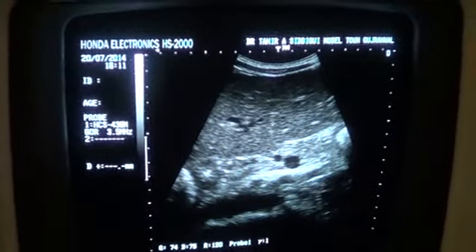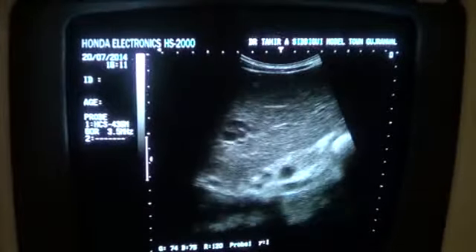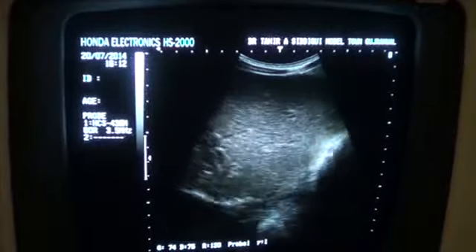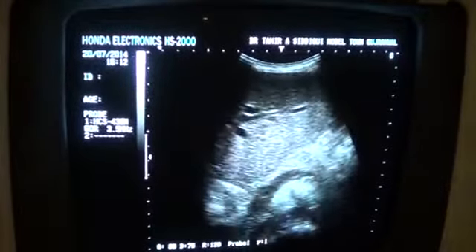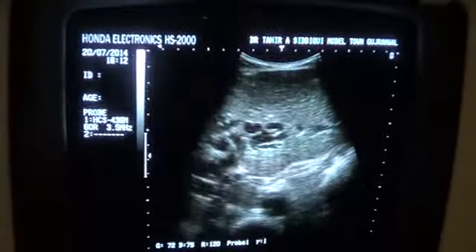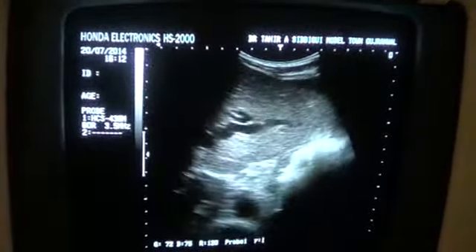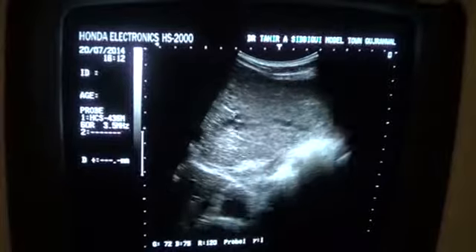The left lobe of the liver is enlarged, seen extending beyond the origin of the superior mesenteric artery from the aorta, and the intrahepatic bile ducts can be seen dilated in this location as well. Now these are all dilated intrahepatic bile ducts that are seen dilated at all levels, and moreover they reach the periphery of the liver. You can see that they reach the periphery of the liver.